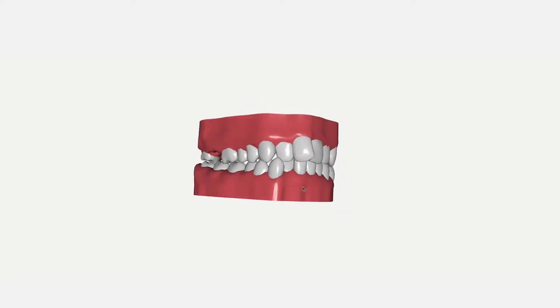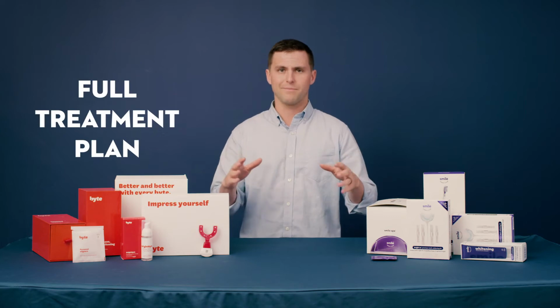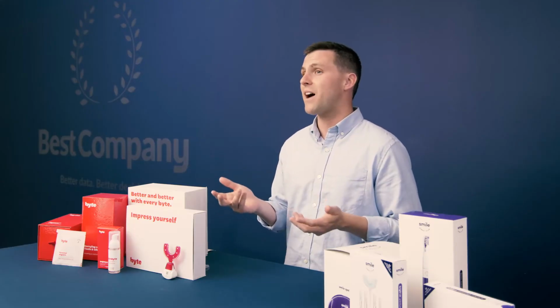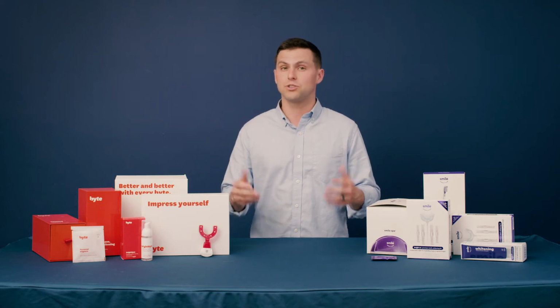Then your customized treatment plan will be sent to you digitally, and it'll be a 3D rendering of the treatment process that you're gonna go through. It's also gonna tell you exactly how long everything's gonna take, what that alignment process is gonna look like. So at this point in the process, you actually get to choose if you wanna move forward with the full treatment plan. That's gonna cost you somewhere around $2,000, which is actually a lot of cost savings compared to those old metal guys that we talked about, those traditional braces. Those can cost you anywhere from $5,000 to $10,000. And many of these companies are gonna have some type of financing options as well as accept dental insurance.